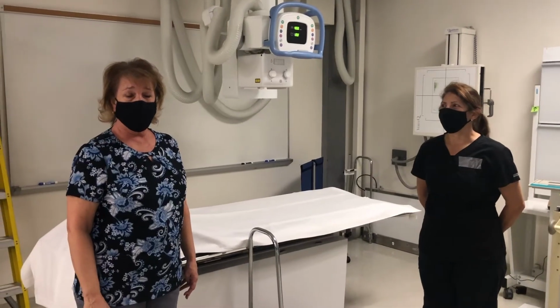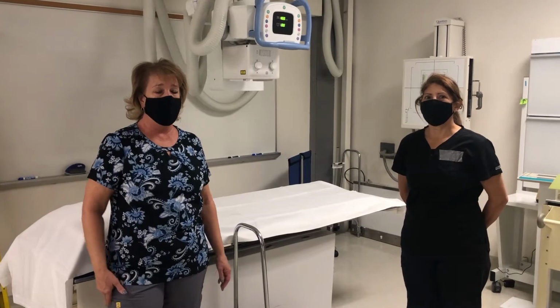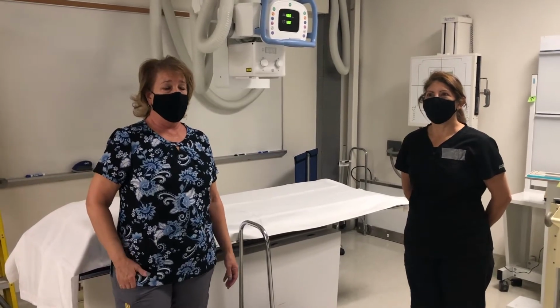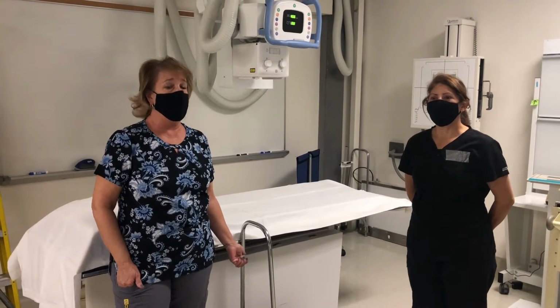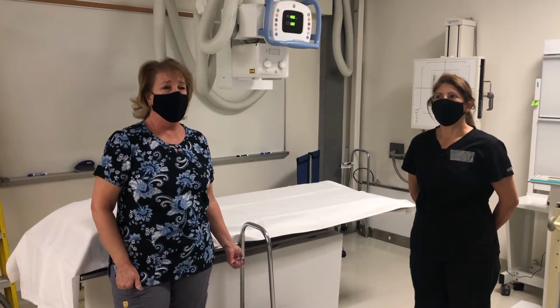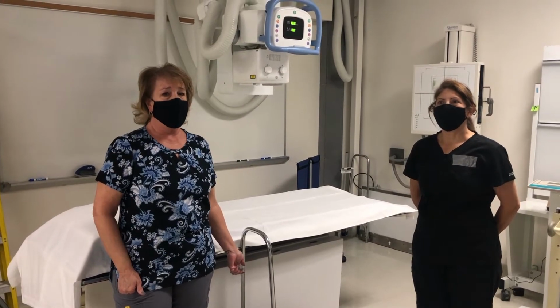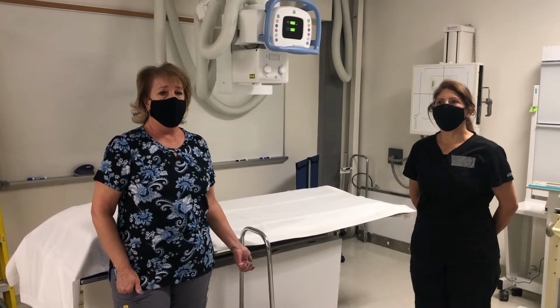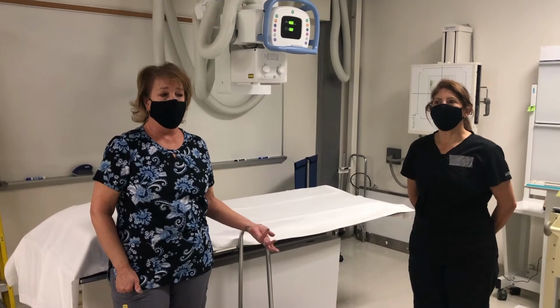Okay, so this demonstration is going to be for intravenous pyelogram, otherwise known as IVP. Your book also refers to an IVU, which is intravenous urogram, but that indicates really just a study of the ureters, and we are studying the kidneys, ureters, and bladder in this study, so we call it an IVP.